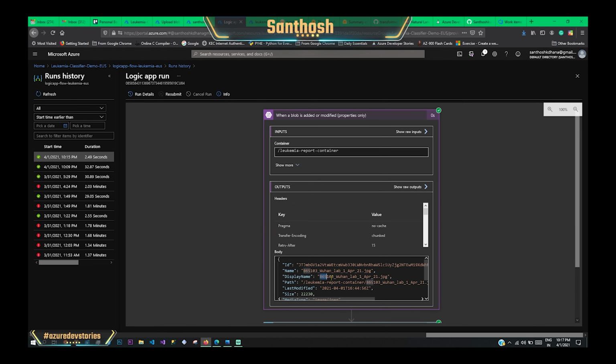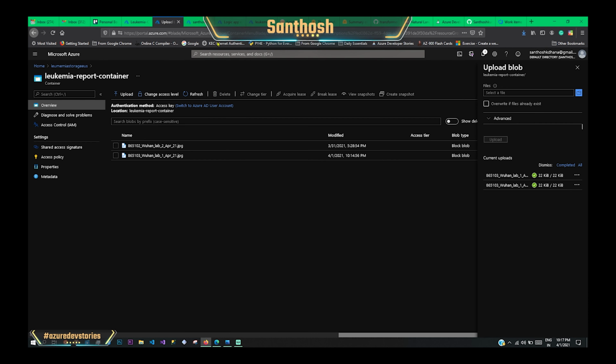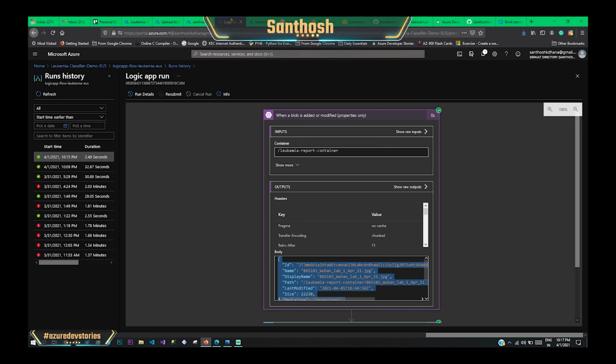So this was the image that we uploaded. If you remember, go there. This is the 3 1 lab, first April 21, and this was the image uploaded. You can see the time on the back here.